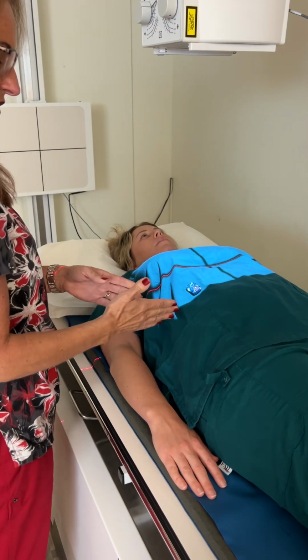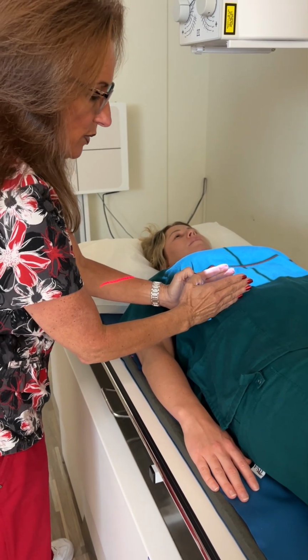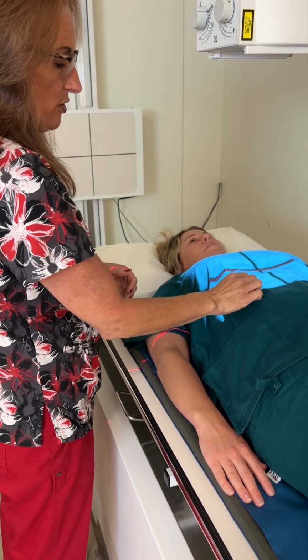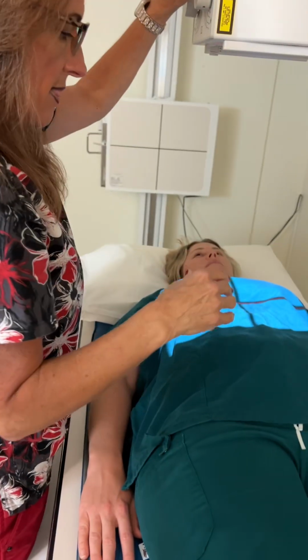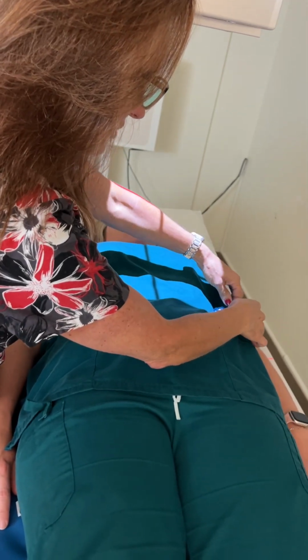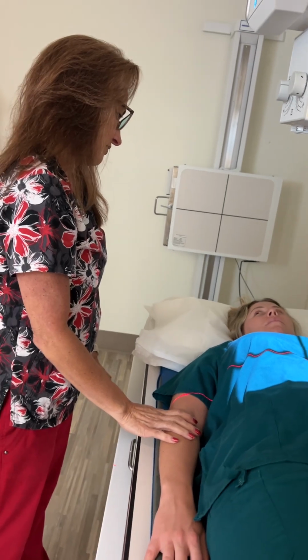And what that proves to the radiologist is that this area right here is overlap. That's probably about 2 inches that will be on the first image and will also be on the second image, so that there's no anatomy that was missed or left out when the radiologist reads that. So I'll make sure she's in the middle, which she is. And then I am going to put this marker on the left side of the patient and make sure that it is visible like that. We're aligned here. And then one more time, I'm going to have you breathe the same way for me, okay?